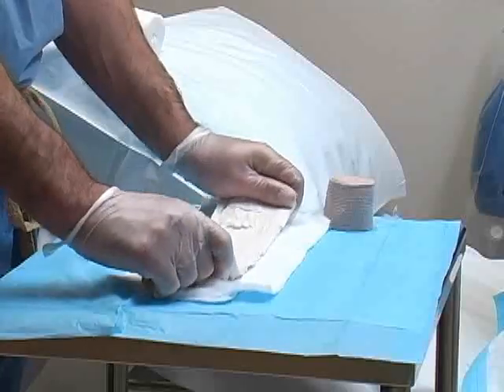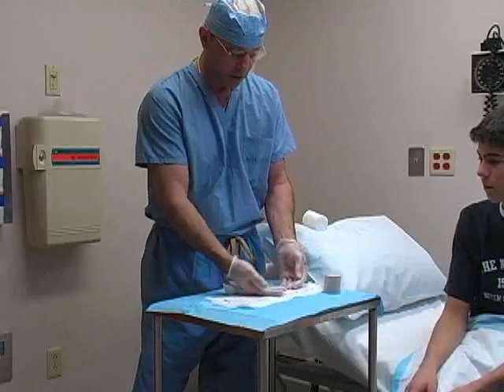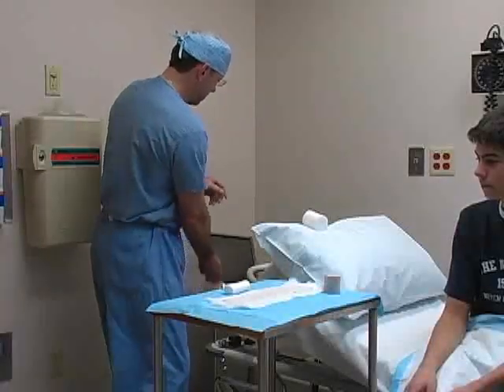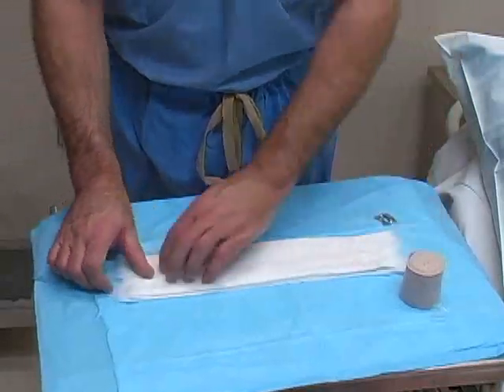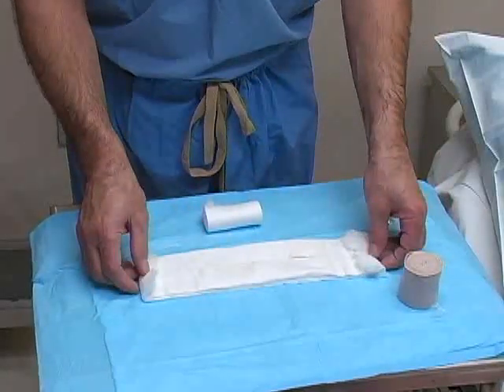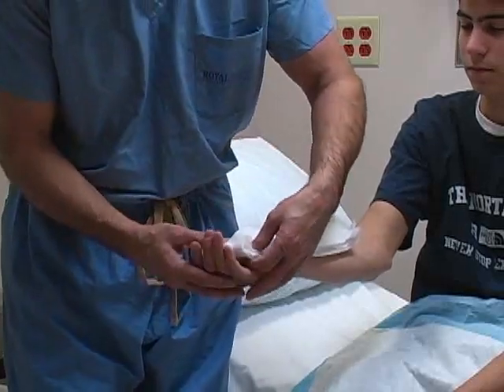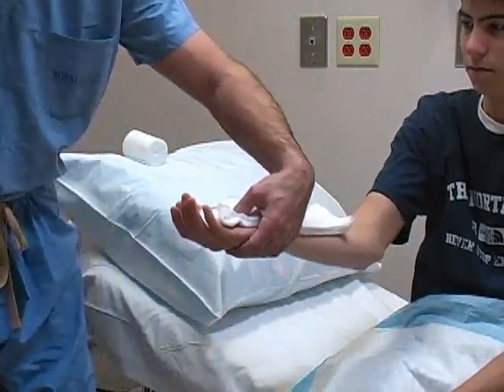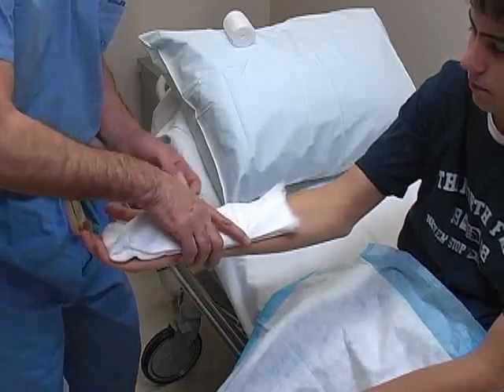Place the wet plaster onto the cast padding and smooth the surface by running your hands over it. This causes the layers to form a single mass of plaster. Fold the overhanging edges of the cast padding over the plaster — this single layer of padding prevents the plaster from adhering to the elastic bandage. Apply the newly constructed splint to the extremity, and gently mold the plaster to the body using the palms of your hands.